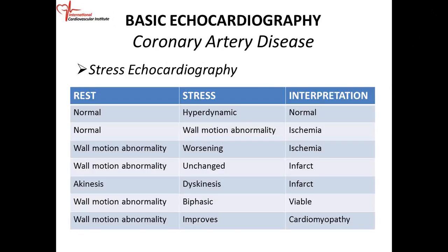When the patient finishes walking on the treadmill, you're going to turn the treadmill off suddenly. So if you were just doing a stress ECG, then you let the patient gradually cool down. With the stress ECG, the patient can gradually cool down and then walk. After you complete the maximum, they can walk for another 4-6 minutes to recover. With the stress echo, there is no recovery. You stop it suddenly and you put them on the gurney, the table, and you start doing your echo.